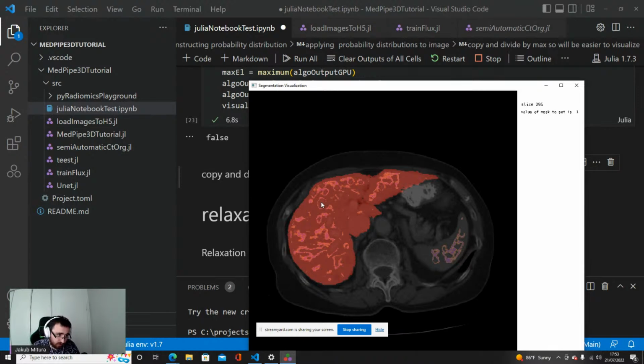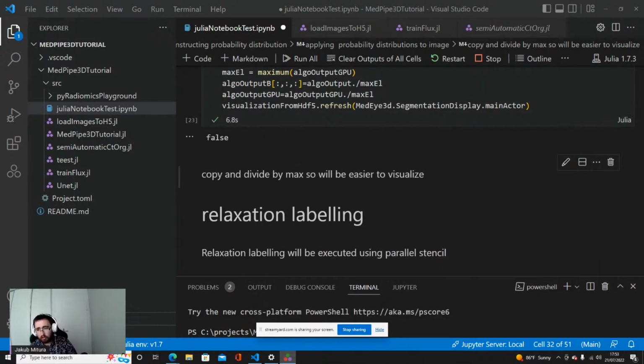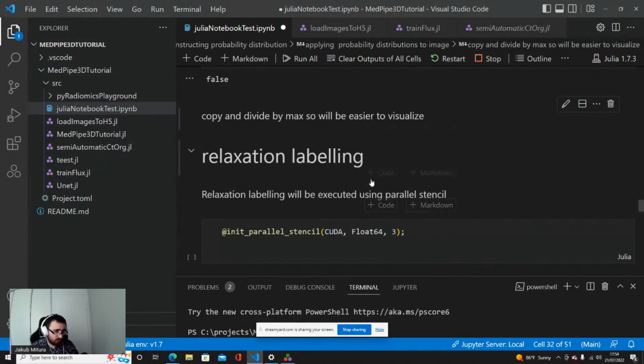So we can use the data about the neighborhood, about the output of our algorithm, to perform the refinement of our algorithm. So our algorithm can get the idea that we have the liver also here and here and here and here, by looking that a lot of voxels around have the high probability. How to do it? The classical algorithm for this is the relaxation labeling.